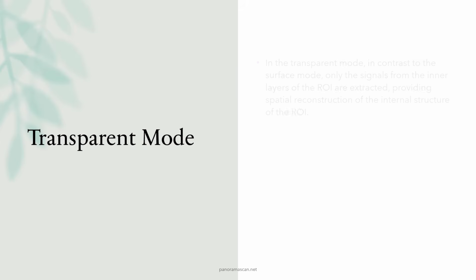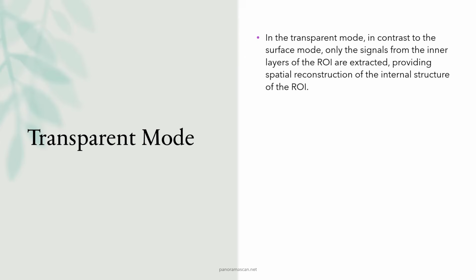Now, let's look at transparent mode, which is designed to highlight the internal structures of the region of interest by extracting signals from deeper within the volume. Unlike surface rendering, transparent mode focuses on the internal layers of the anatomy. This mode is excellent for creating spatial reconstructions of internal structures, helping clinicians visualize what lies beneath the surface.